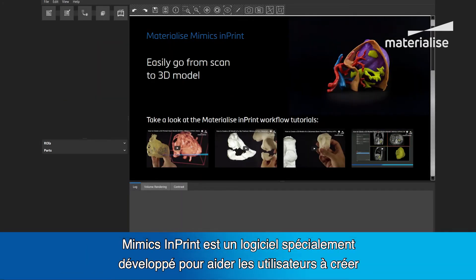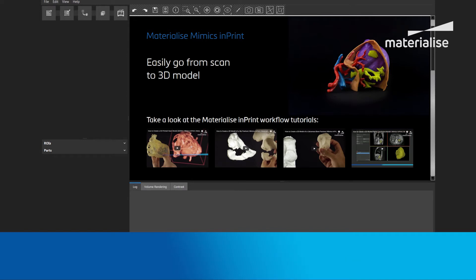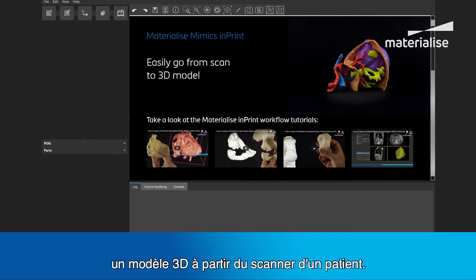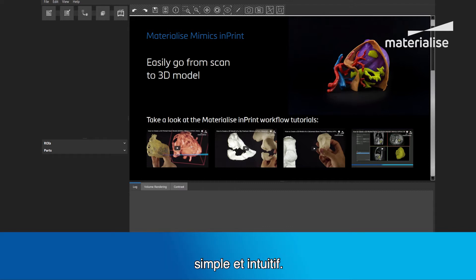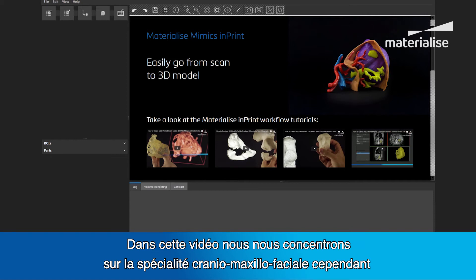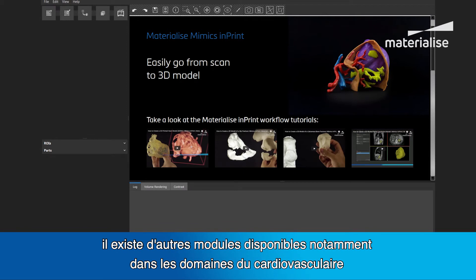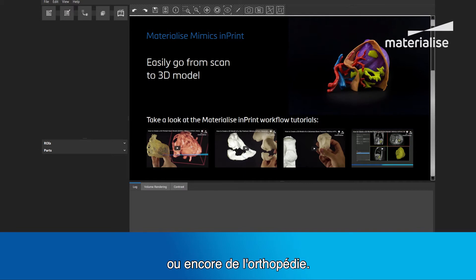Mimix Imprint is a software program especially developed to help users go from a medical scan to a 3D model. It uses a very powerful yet simple predefined workflow to minimize time and optimize user friendliness. This video focuses on the cranio-maxilio-facial applications of Imprint. However, there are other modules available, such as for the cardiovascular and orthopedic fields.